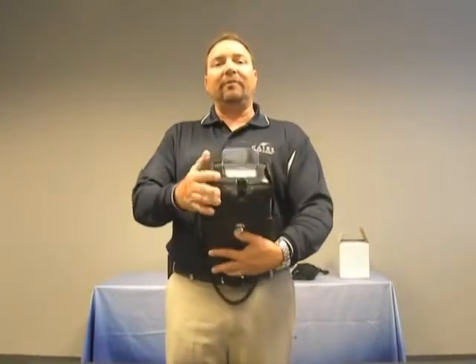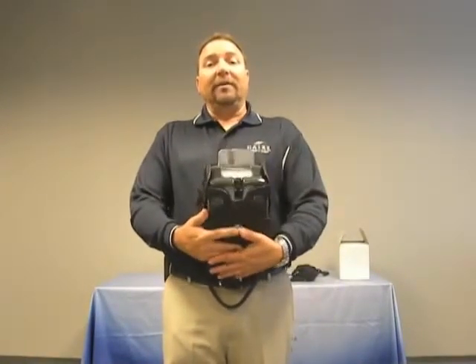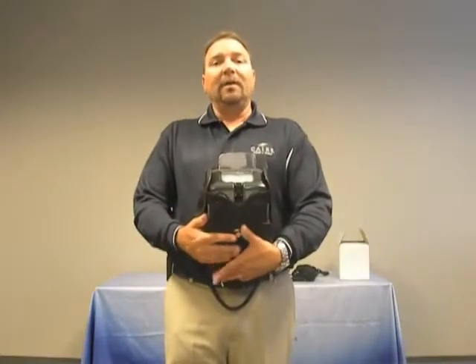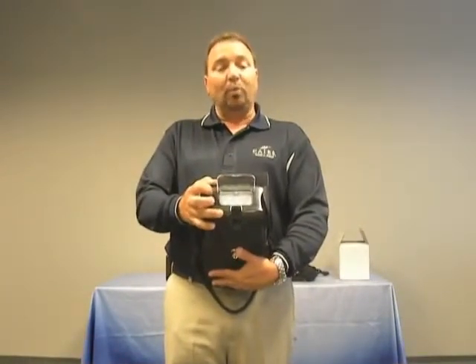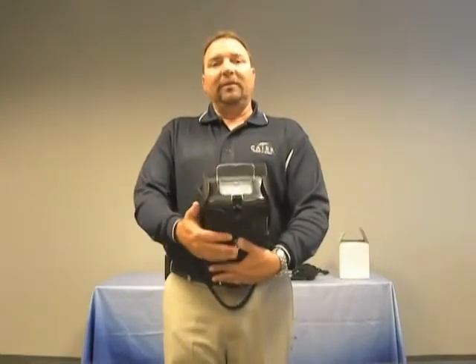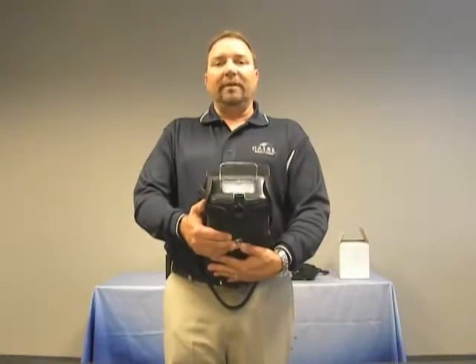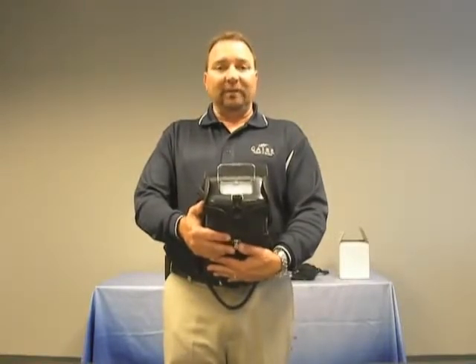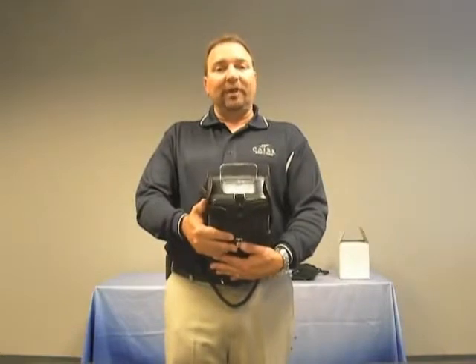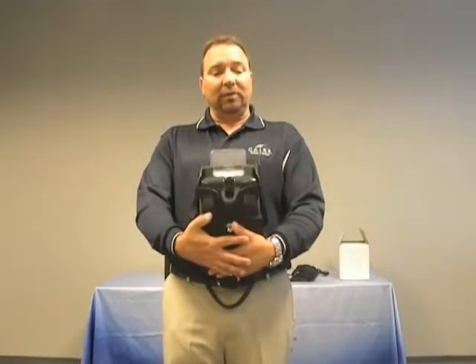This prevents the FreeStyle from shutting down and the air belt not being able to provide the ability to turn the FreeStyle back on. The second audible alarm and visual alarm for the battery would also be a 25% light with an intermittent rapid audible alarm. This is an indication that the battery is ready to shut down, and at this point it's critical that the patient find either AC or DC power to plug the FreeStyle 5 into. Keep in mind, any time that the FreeStyle 5 is plugged into AC or DC, it will charge the battery simultaneously while it's in use.